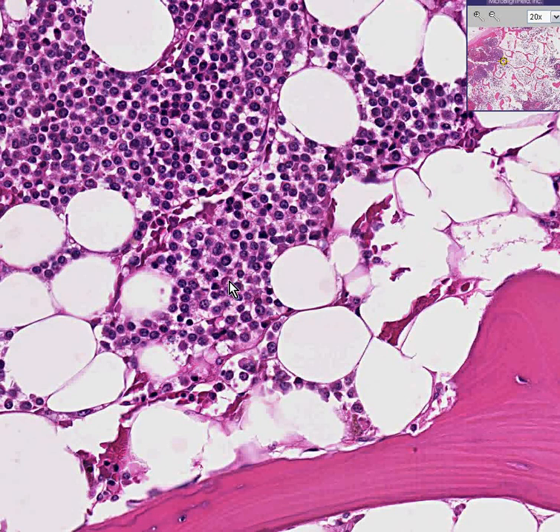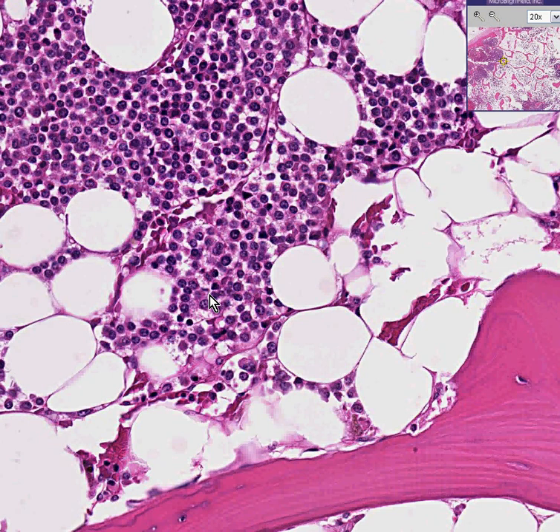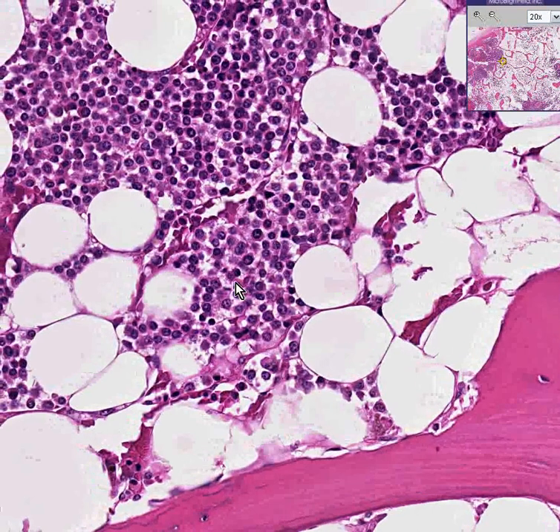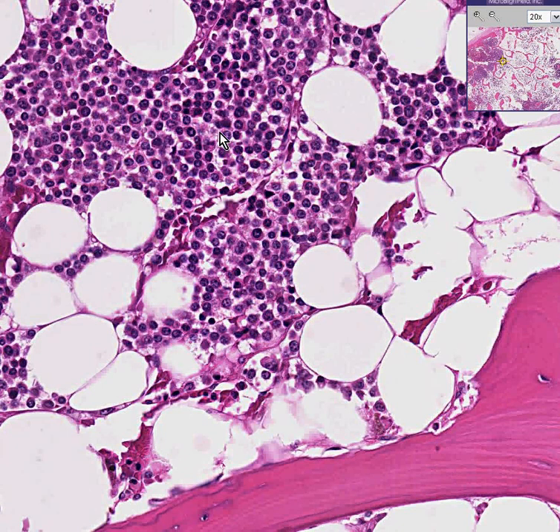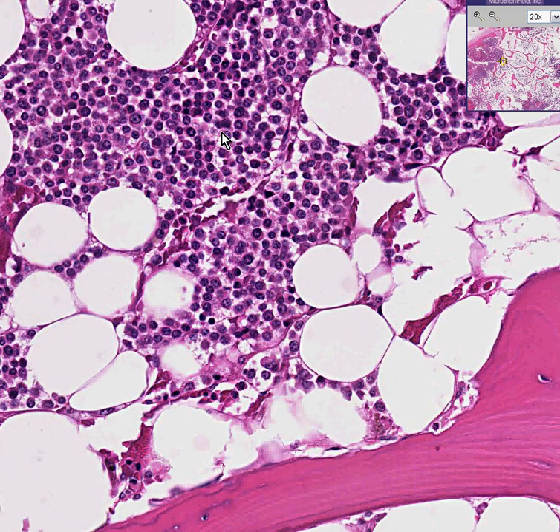Look at this cell here — notice how the chromatin is sort of at the periphery of the nucleus. Look at this cell here — notice how there is a prominent lip of cytoplasm to the side. And if you were to have the benefit of either a better stain or a higher power, I can reassure you these are all plasma cells.